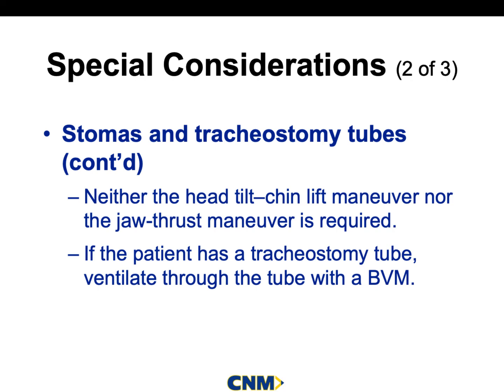And the best thing in medicine, you guys are going to learn this real quick when you get out there, is obviously not everything is universal, okay? But what they did do right in medicine is that the tracheotomy tube is universal. The actual connection is universal with your BVM mask. So all you have to do is hook up your BVM to the tracheotomy and squeeze when the patient's breathing.